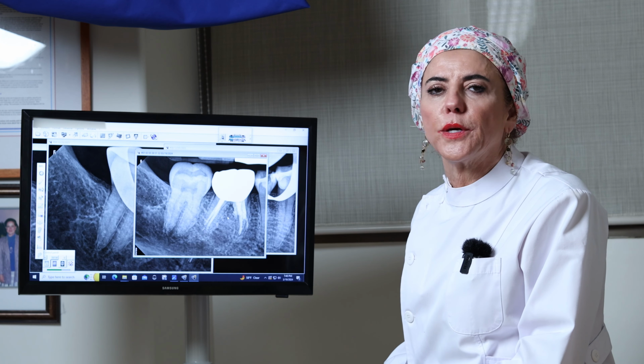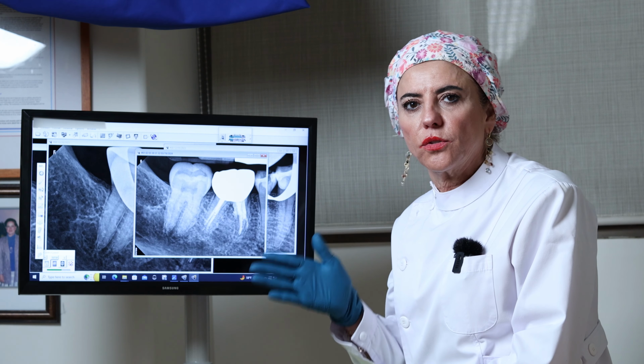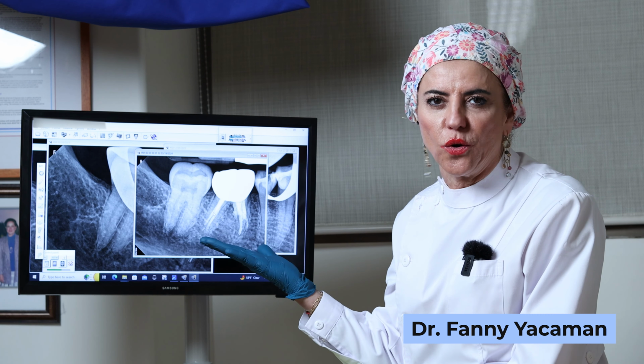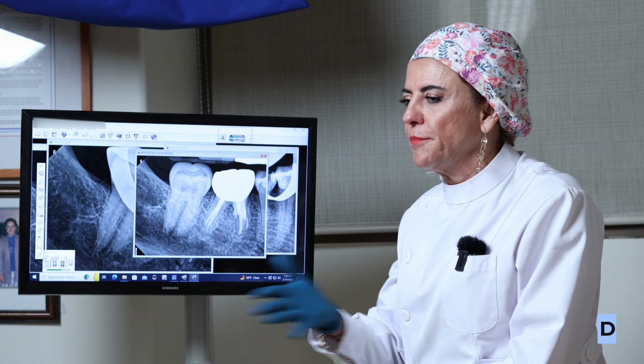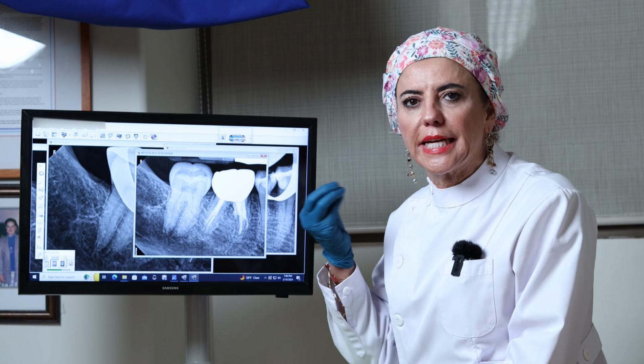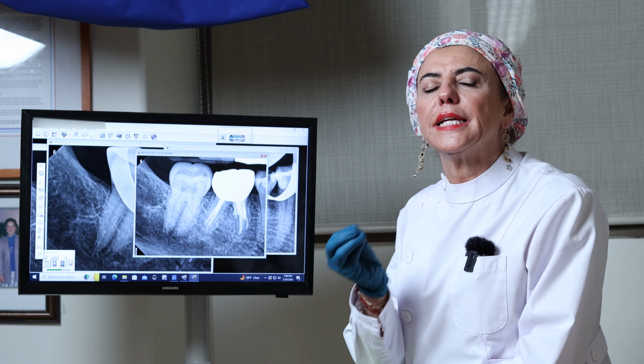It's not the end of the world as long as the endodontist is irrigating. My mentor in Mexico City, Dr. Silva Herzog, always used to say, irrigate until the patient is under the water. It was kind of a joke, right? That the patient has to be swimming because we're irrigating so much. Meaning we have to clean the canals as much as we can to complete the cleaning.